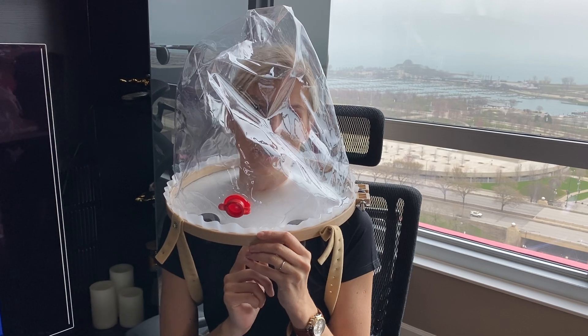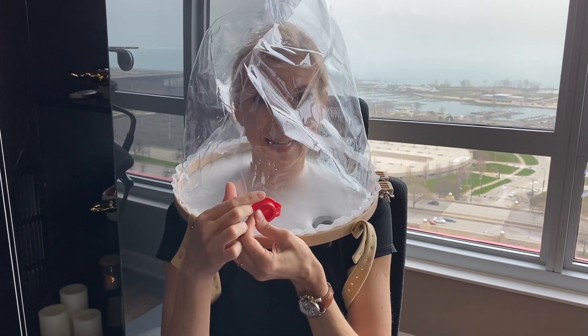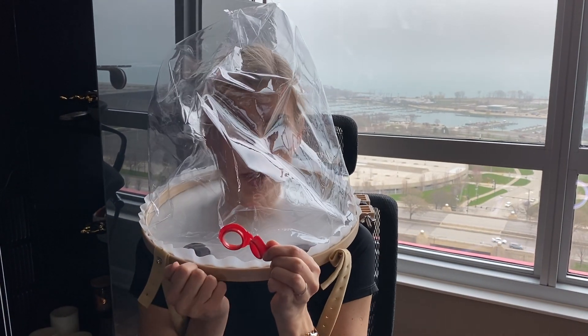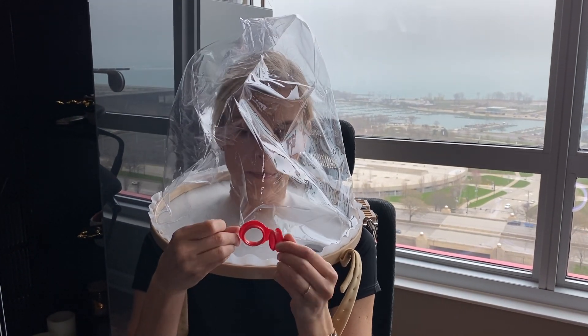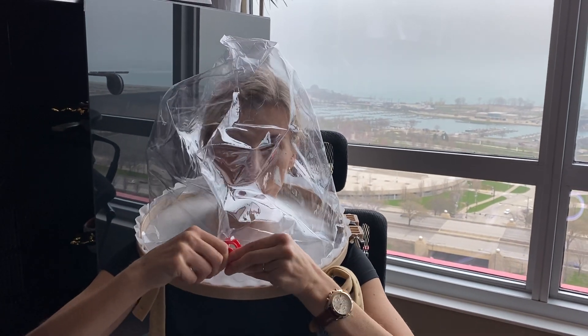Other models have it on the bottom part. This is in front of the patient, so that seems pretty comfortable. You can open it to do suctioning or give a sip of water for the patient, and close it to make sure that there are no air leaks.